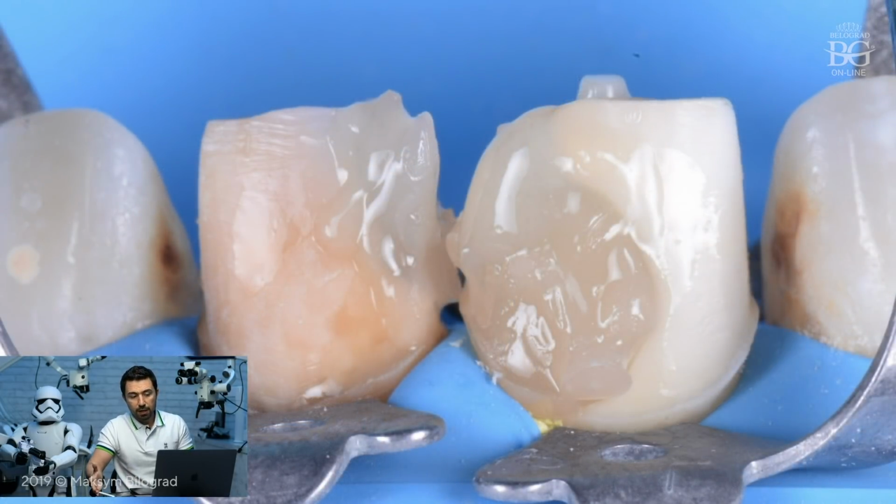In this case, we used fiber posts and core build-up composite material to restore the coronal part. Actually, it was a fiber post and core, because we cemented the fiber post using this core material. So we have one solid piece of post, intracoronal and intra-root build-up with the same material, in one shot. So build-ups are done. You can see the geometry, so it will be easy for you to understand where you need to improve your preparations.